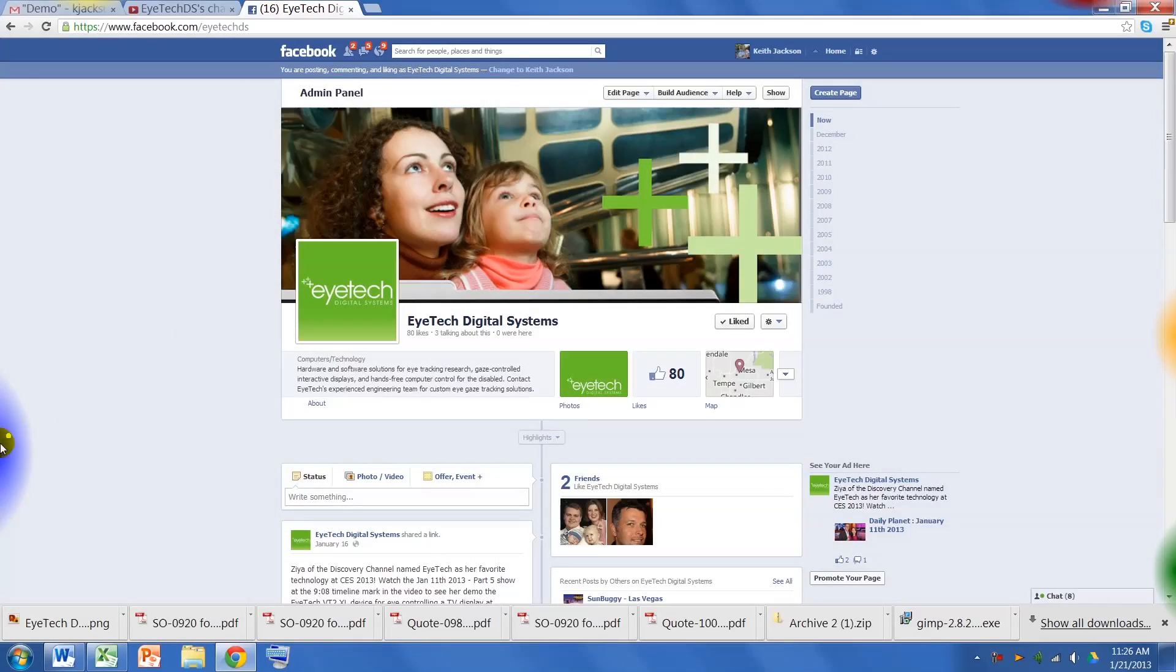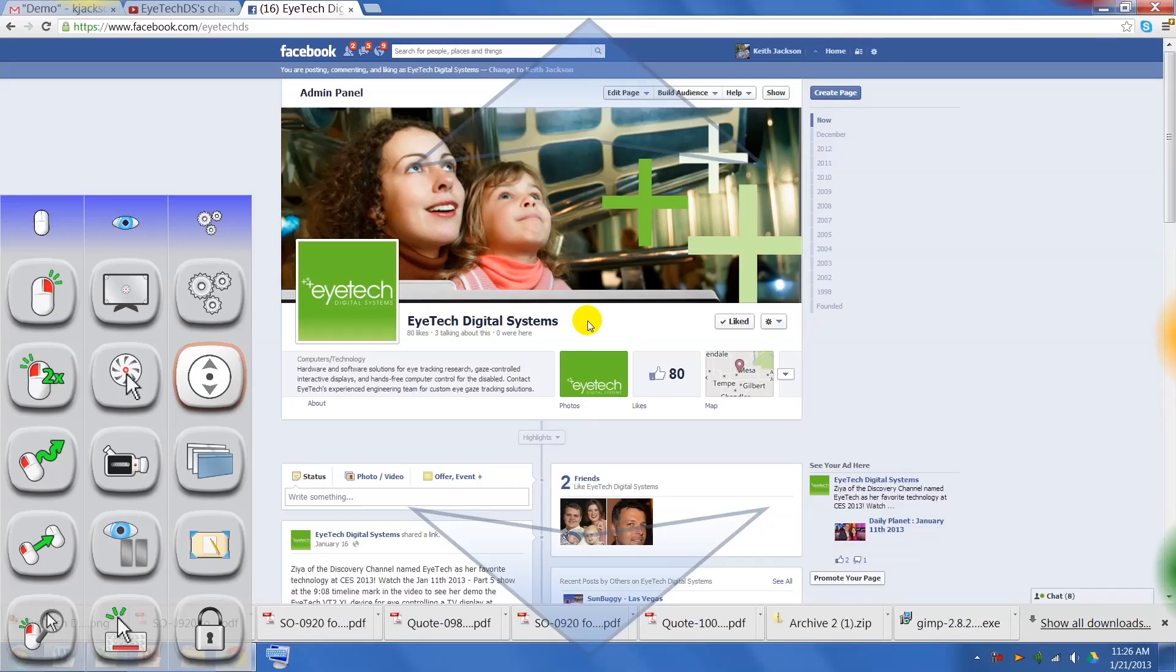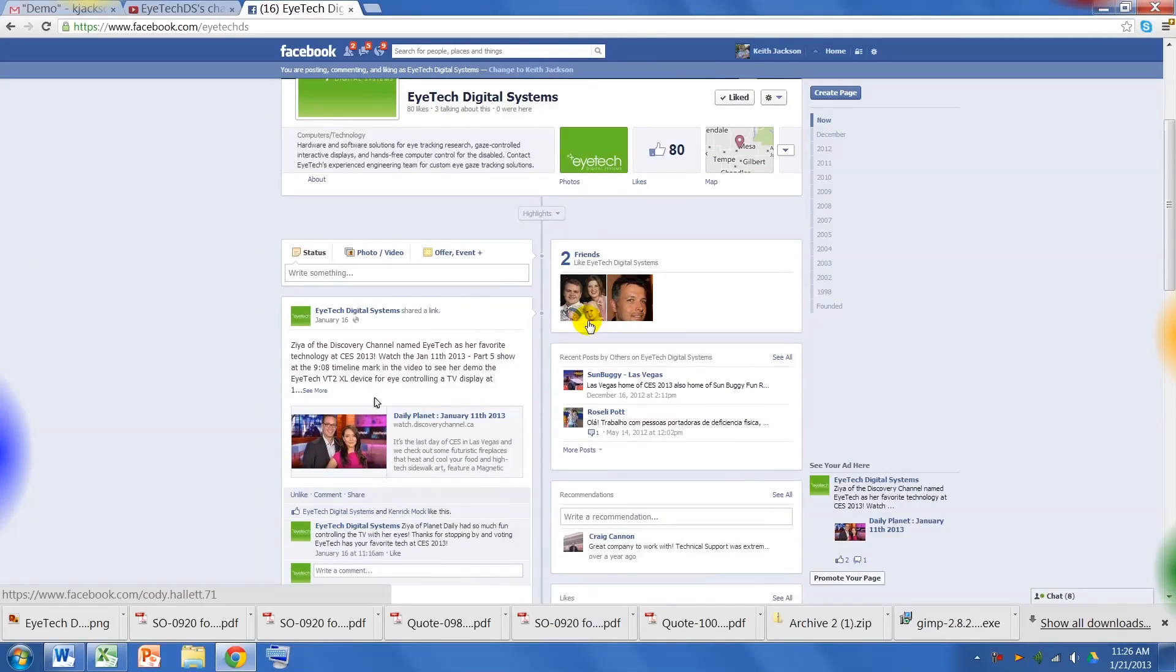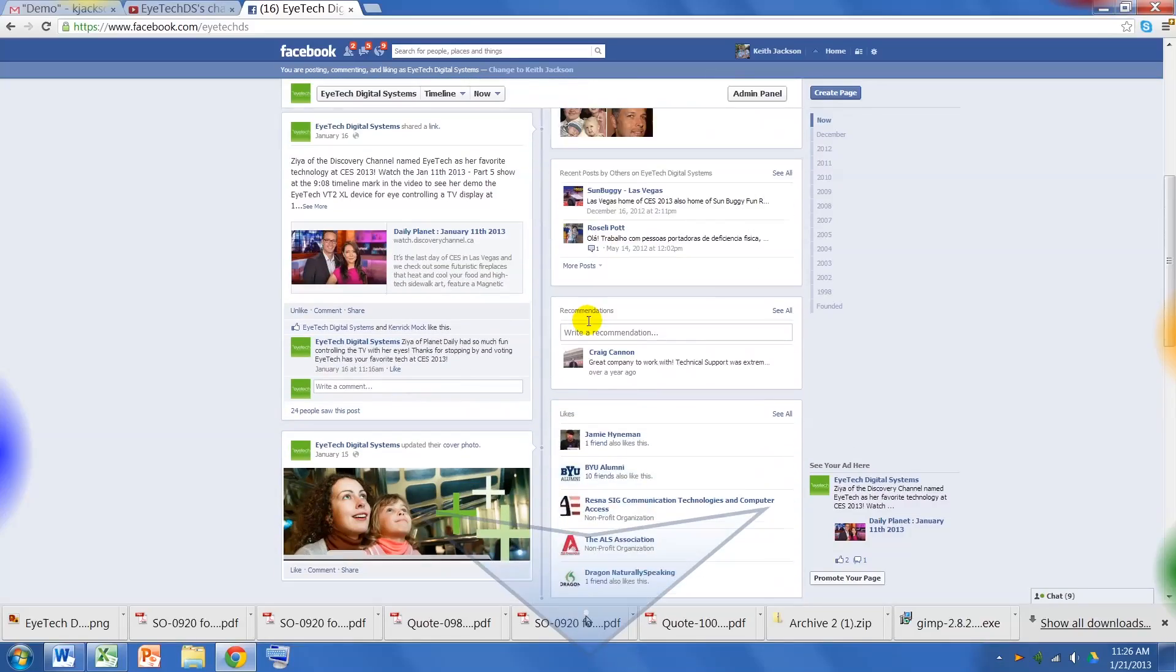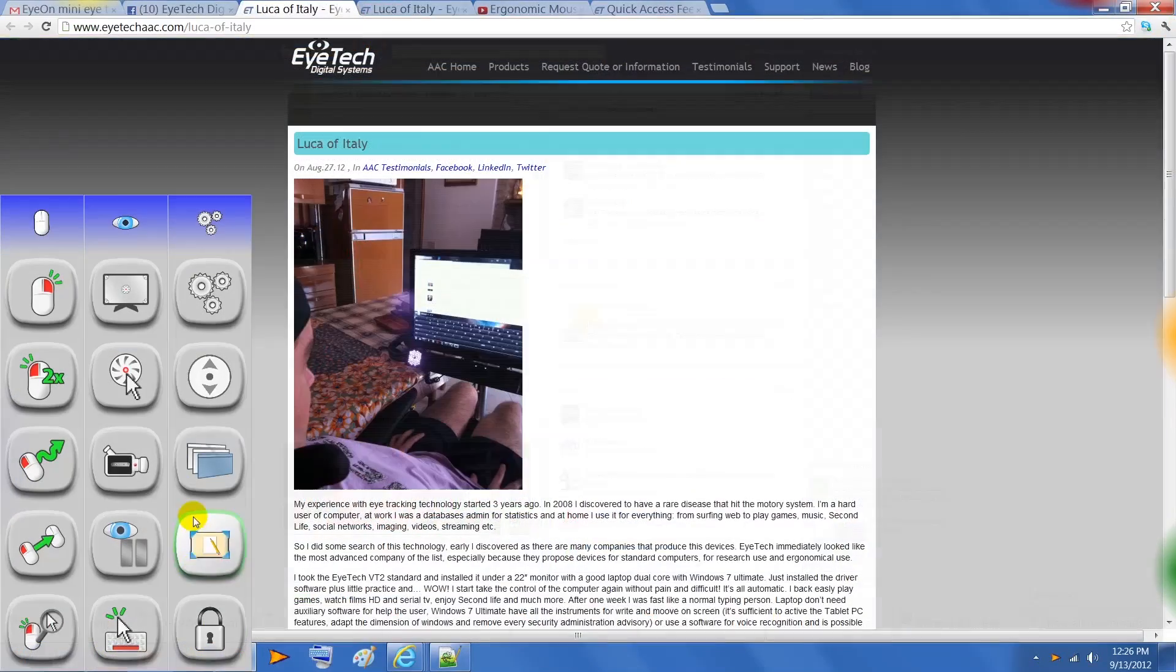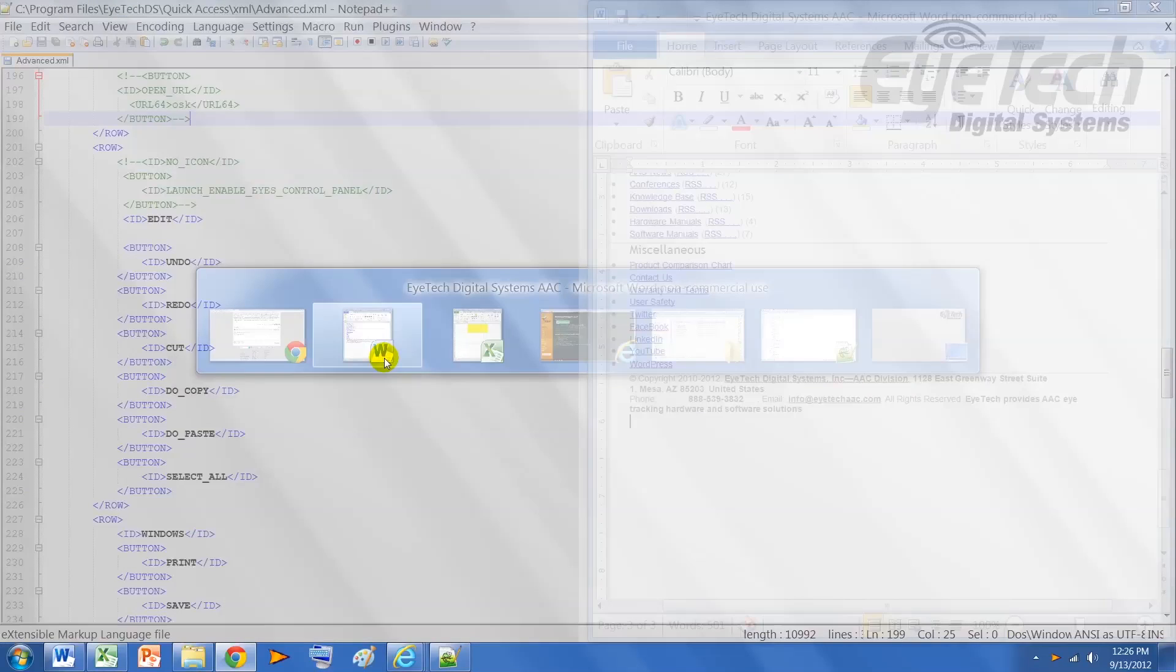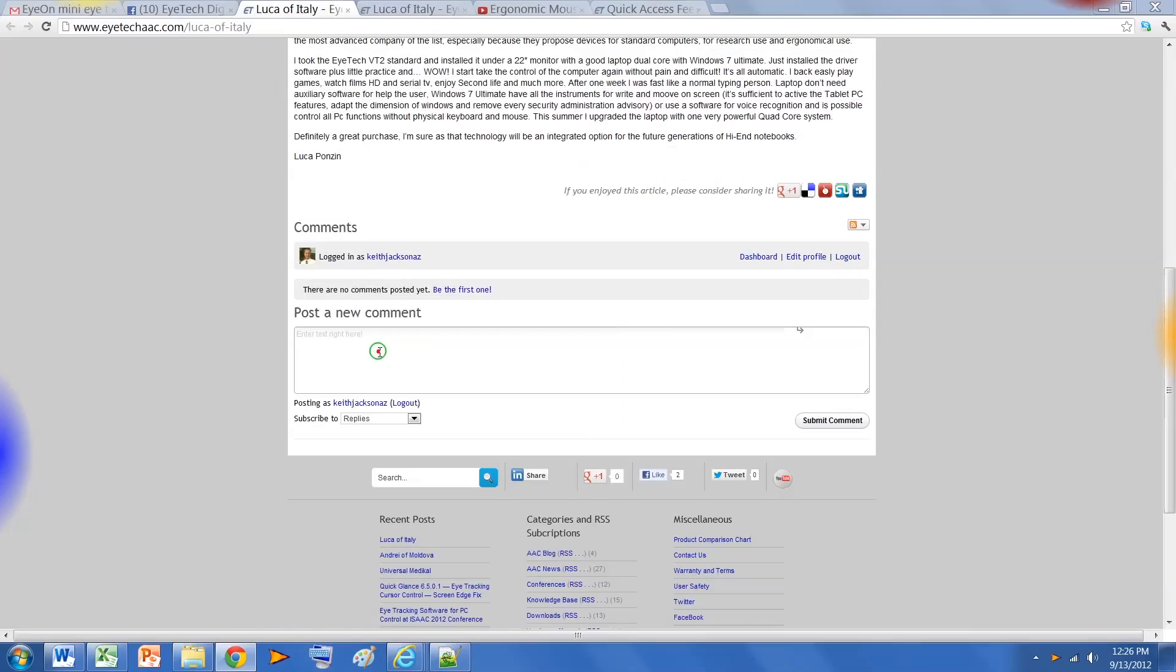Our new eye scroll enables easy and natural scrolling on any window. Two arrows appear to indicate the mode. Just look up or down at the arrows to scroll. The new application switch shows a pop-up with an icon for all open applications, including the desktop. Click on one of the icons to easily switch between applications.